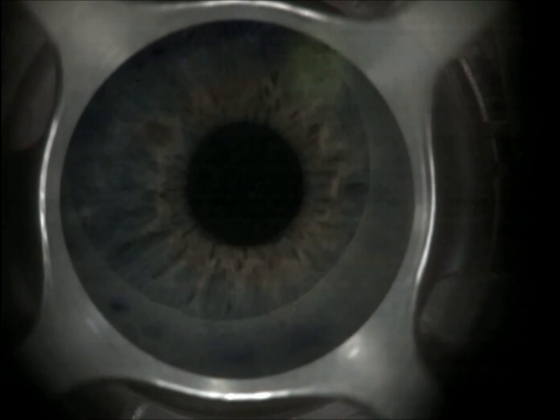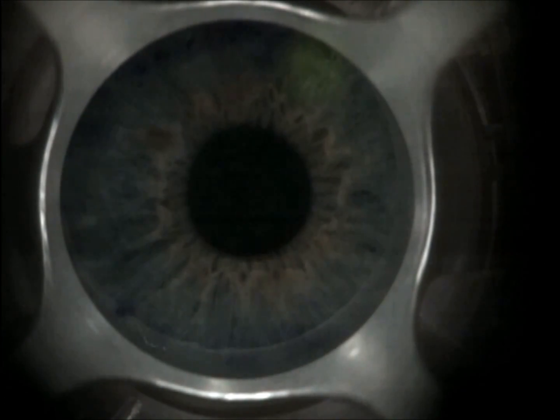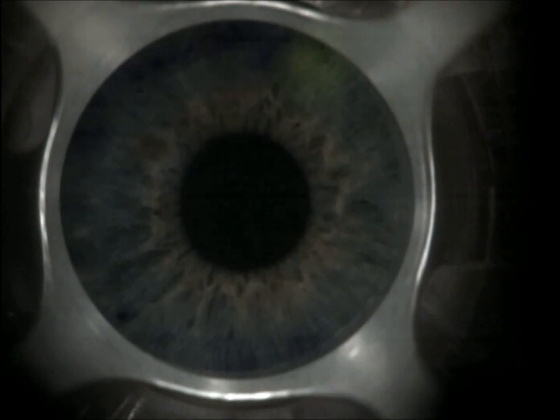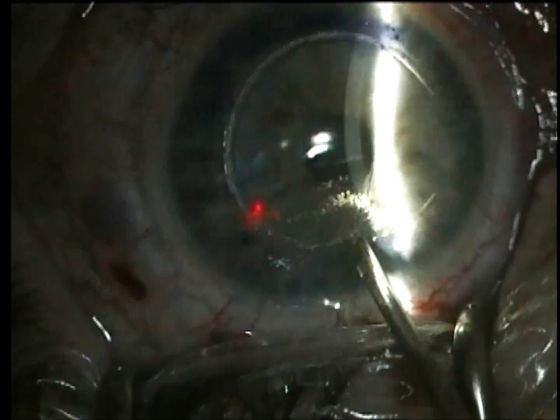You can see we marked the surface of the cornea with a plastic surgery marker. We actually delineated the old flap with the hypodermic needle and then stained it so we can make sure our intralase ablation is within those marks, so we're smaller than the original diameter of the flap.